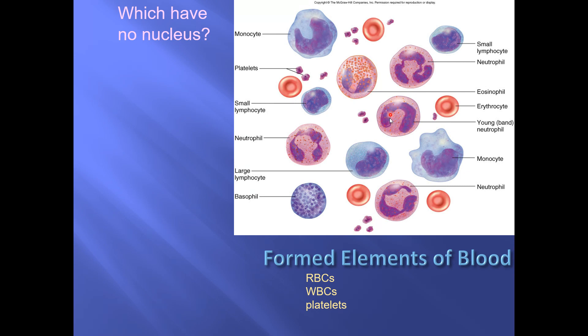When neutrophils are young and have just come out of the bone marrow, the nucleus has a horseshoe look — that's a neutrophil. This other cell has a nucleus that looks like a swimming pool. It's a very large cell that is not particularly round — that's a monocyte. Over here, this small cell has a nucleus that looks oval or round and occupies almost the entire cell, with barely any cytoplasm — that's a lymphocyte, no matter what color it is.